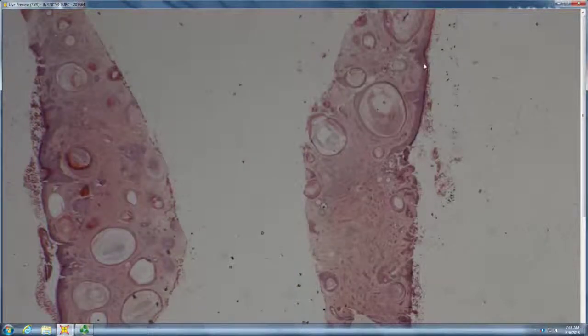So what have we learned? Number one, I'm a liar, right? And number two, clinical pathologic correlation for the Paisley tie differential. This one you can tell is more of a plaque lesion. It has a central dell. It came from the cheek of a young woman. So that's a DTE, desmoplastic trichoepithelioma. Remember, in terms of distribution, a MAC, microcystic adnexal carcinoma, tends to be upper lip and chin, right where the sauce of a Big Mac hits you. So that's easy to remember.